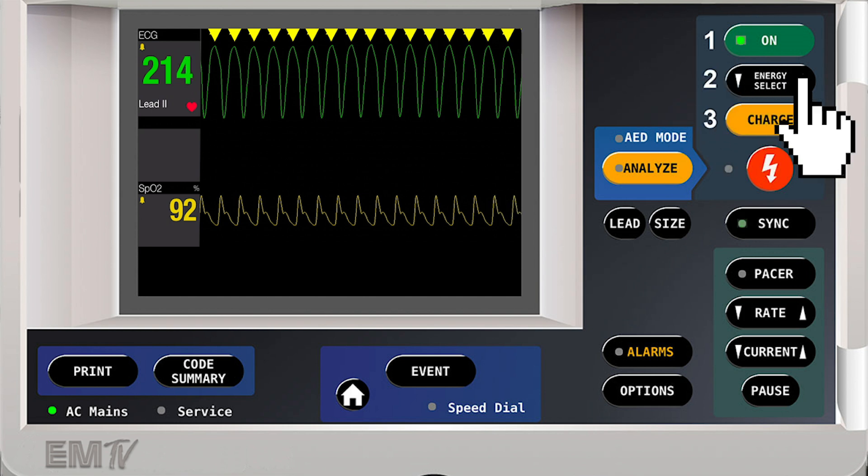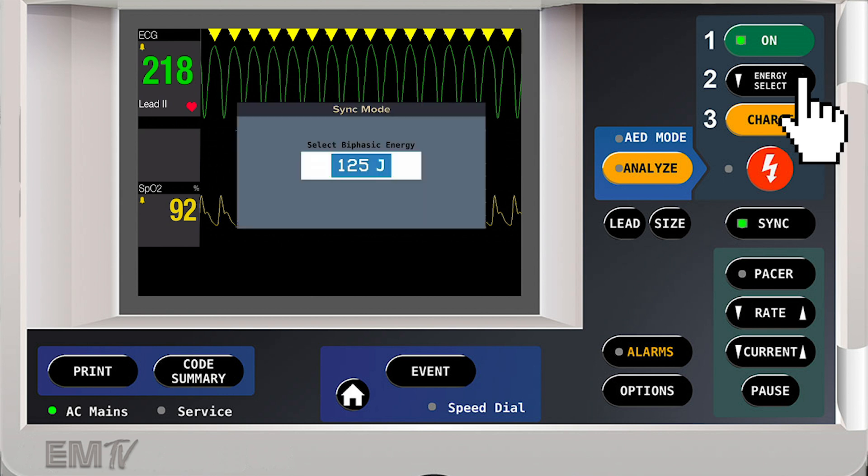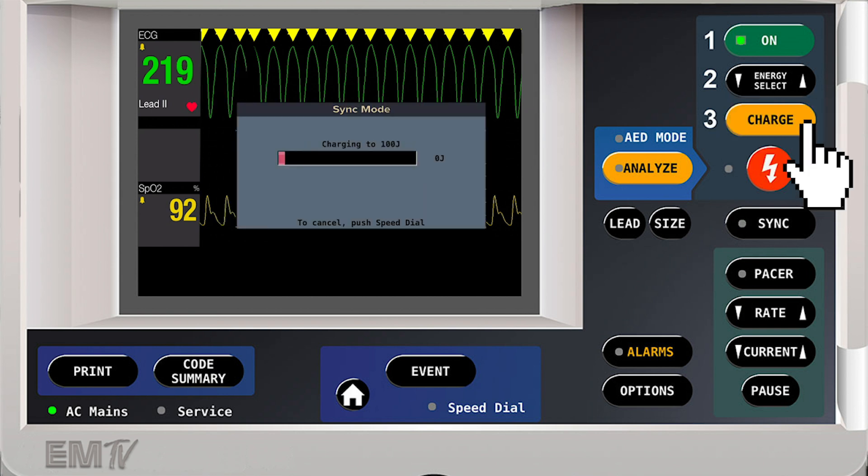The next step is to select energy. Synchronized cardioversion requires less energy than defibrillation because energy can be delivered more precisely. I'll select my energy and then hit charge.